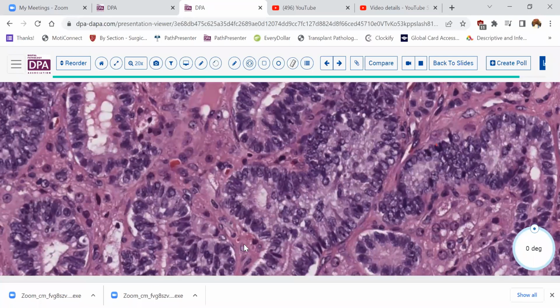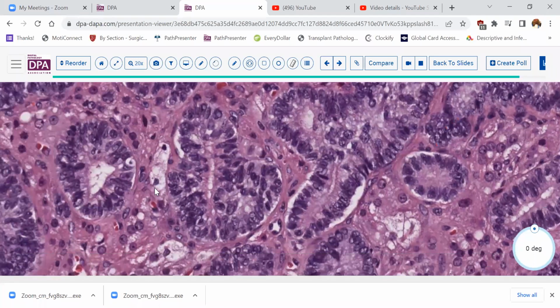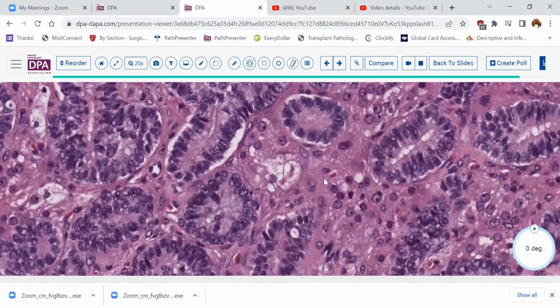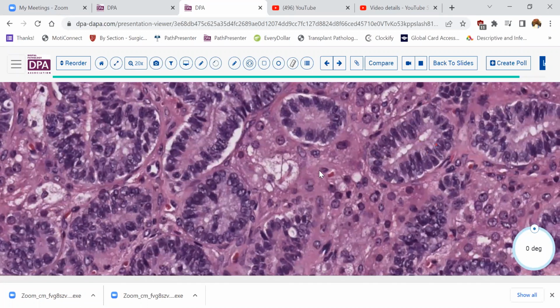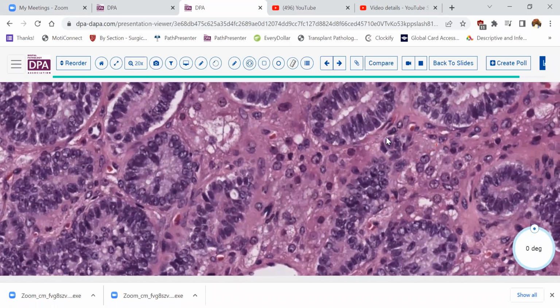Here's a few more over here. And these are very, very helpful if they're present, but they're only present in a minority of these cases. So you don't have to be very strict in that identification of that criterion to establish the presence of Leydig cells. When you find it, it's very useful. When it's not present, you don't necessarily have to discard the diagnosis. Now, in most cases, this morphologic finding, the classic H&E morphology would be entirely adequate to make the diagnosis.